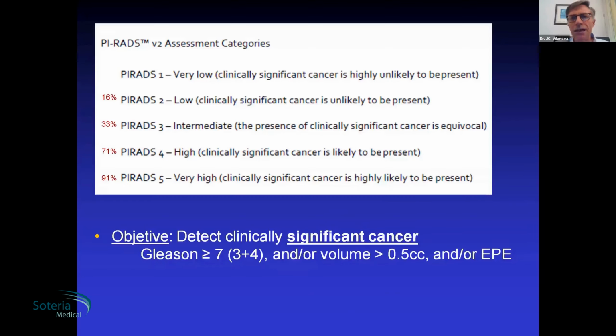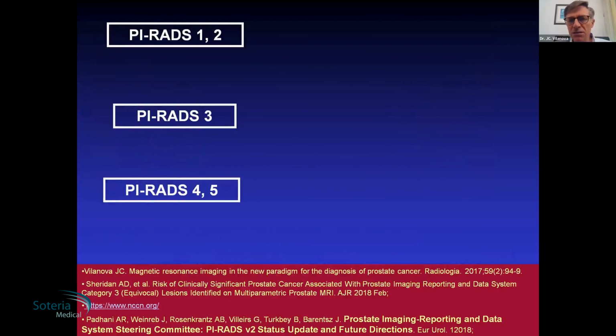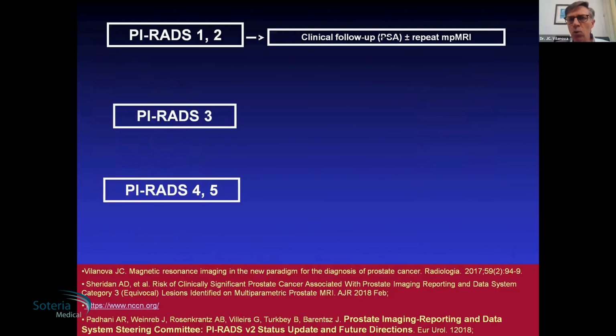There have been patients without any imaging, and as we have seen, only 45% of cancer detection. Using MRI, at least 70% detection. So that's the issue. We know that we are going to lose and omit some significant cancer, of course, but less than not having an MRI. So this is the main challenge in managing our patients, because whether the MRI is score 1 or 2, we are going to avoid the biopsies. And whether the patient has a PIRADS 4 or 5, the recommendation is to have the biopsy.